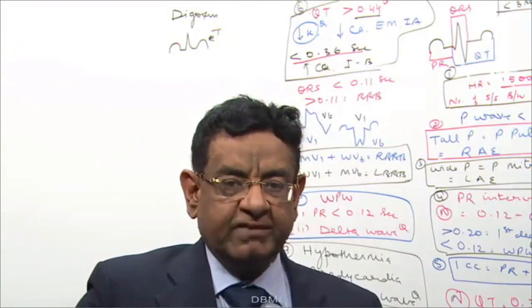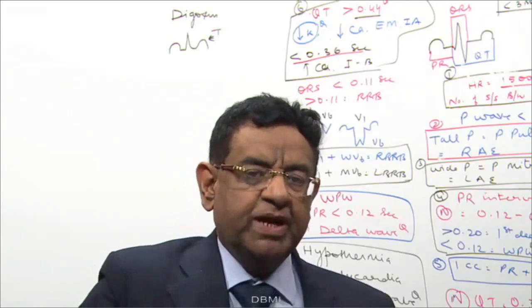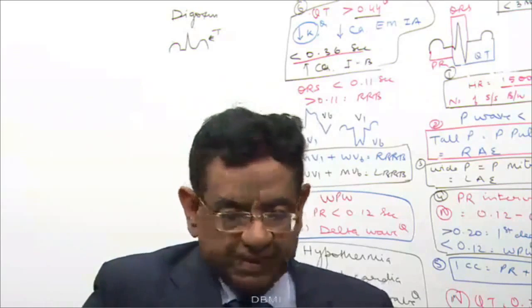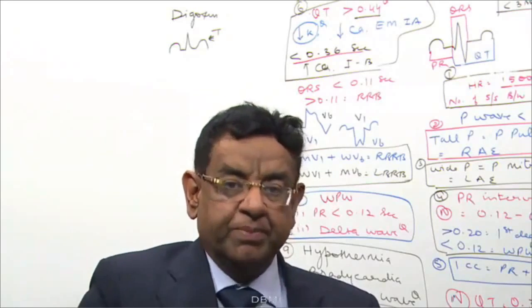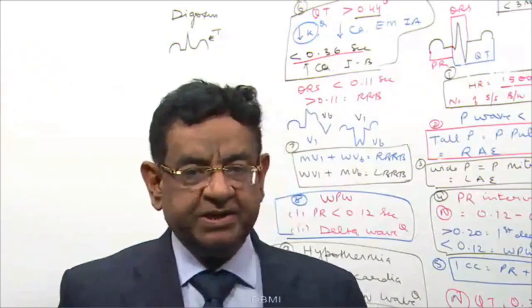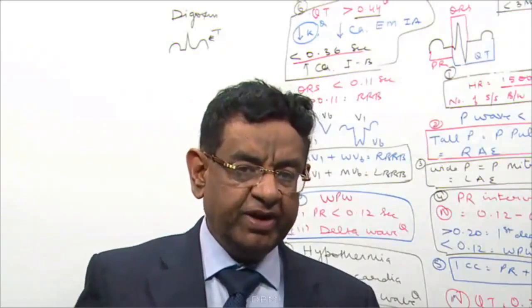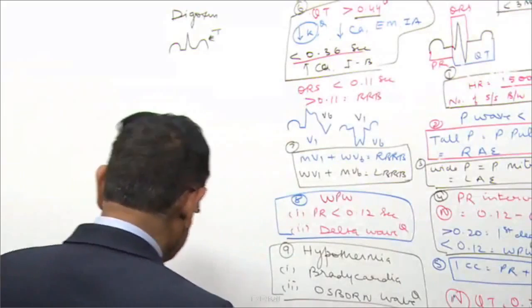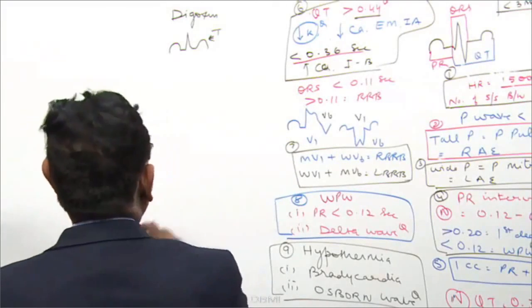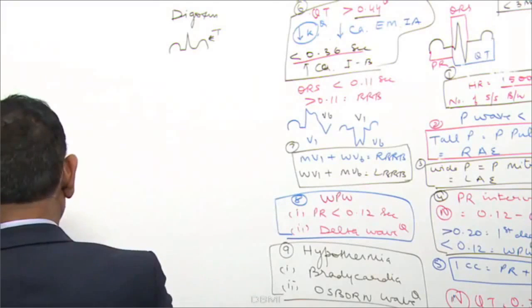I say you take 1 tablet of digoxin, you come back to me after say 1 month. He comes back to me after 1 month and says, doctor, I am much better. My condition is much better. I feel much improved. So as a clinician, I can understand he has been adequately digitalized. Now if I do recording, then the recording becomes like this.